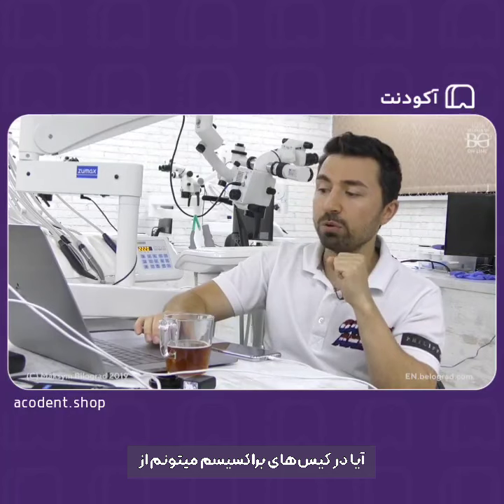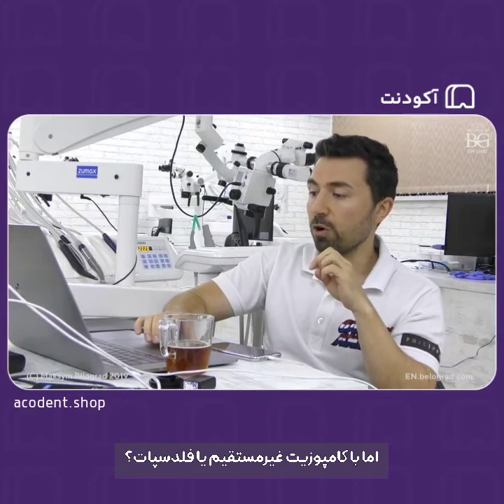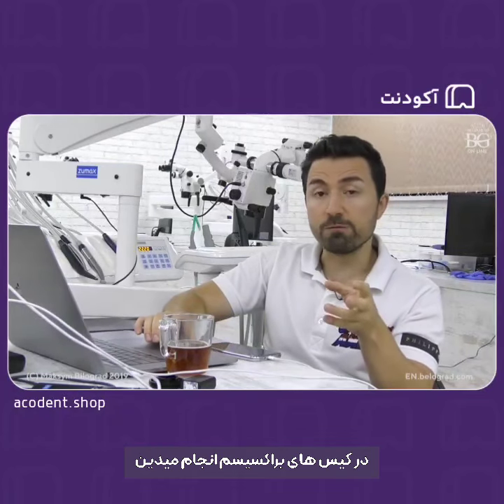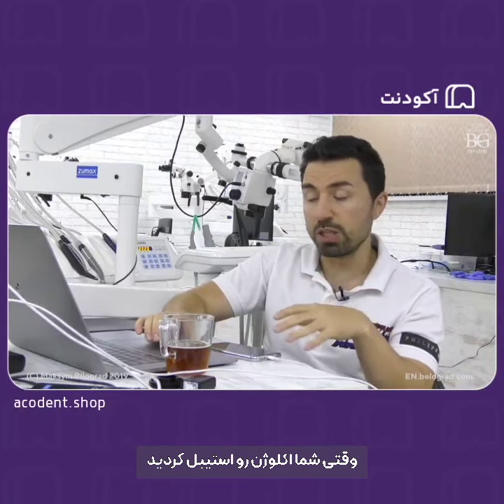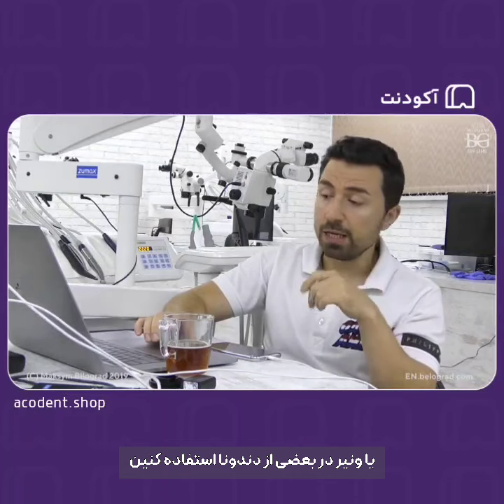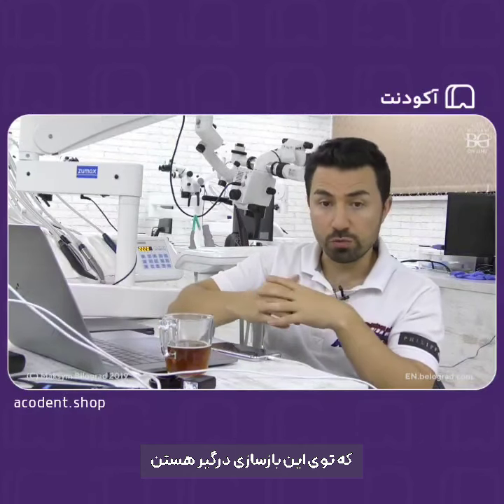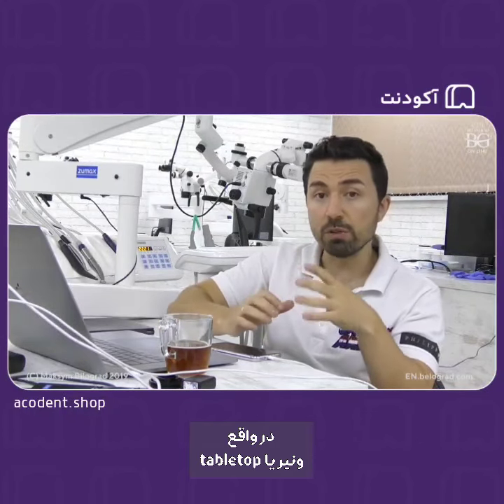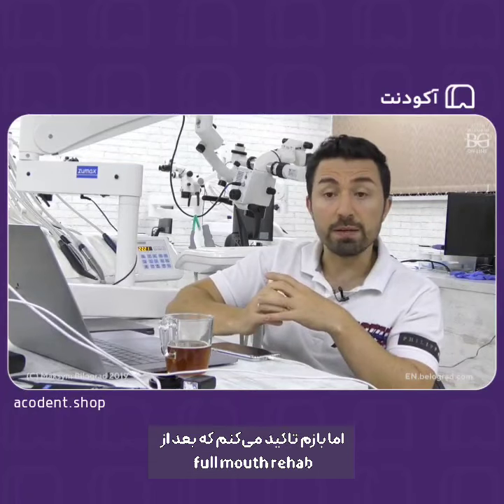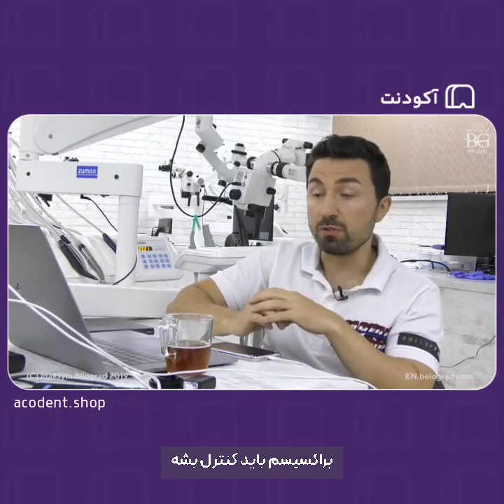Can we indicate tabletops and veneers, but with indirect composite or feldspathic? When you have a bruxist and you do a full mouth rehab case, when you manage occlusion, when you stabilize occlusion, you can do tabletop restorations, and also you can do veneer restorations for some of the teeth that will be involved in this full mouth reconstruction. So it's not a contraindication. Tabletops and veneers are not a contraindication for bruxism, but again, the bruxism has to be controlled after full mouth rehab treatment.